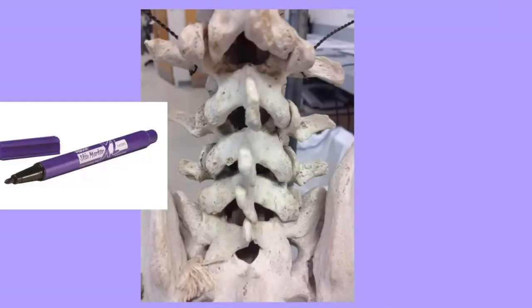To be honest with you, we're going to talk about the setup of the procedure. The hardest part, I think, is going to be finding a skin marker. Has anyone ever seen this? Oh, it's in the lumbar puncture kit? Oh, great. All right, so it's in the kits. I didn't know that. But regardless, if you can't find that, I was just informed this morning by JFK that you can use a Sharpie.